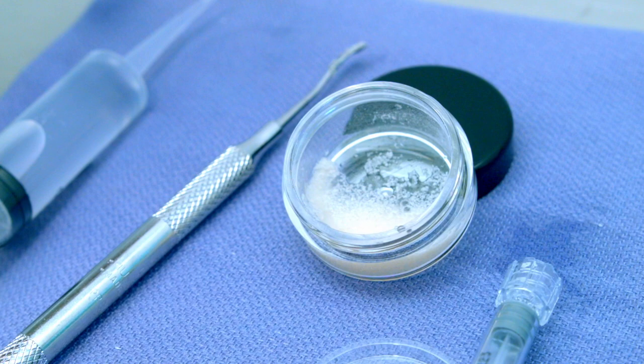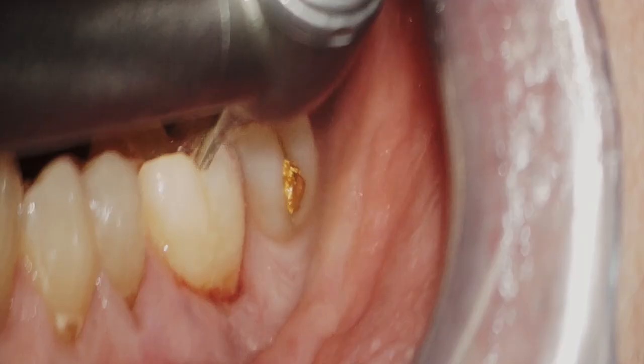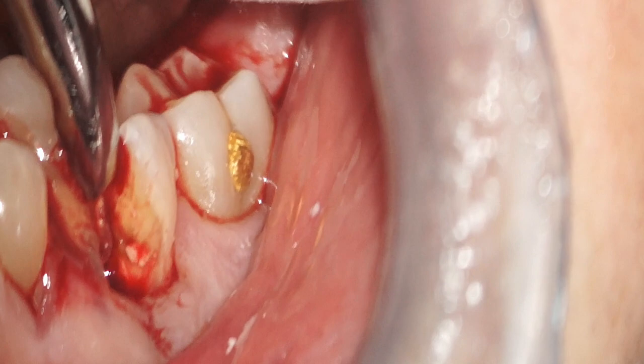Looking at a clinical example, here we have a tooth with a vertical fracture and 100% bone loss. My goal is to demonstrate how I manage a site with such advanced bone loss using a minimally invasive technique. I will section the molar so that the mesial and distal roots can be removed atraumatically, using elevation and a micro-forcep to remove each root individually. You can see the soft tissues on the buccal surface moving because all bone support — 100% — has been lost on the buccal surface.